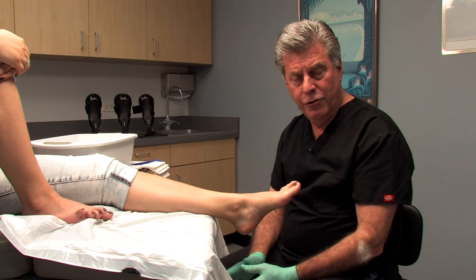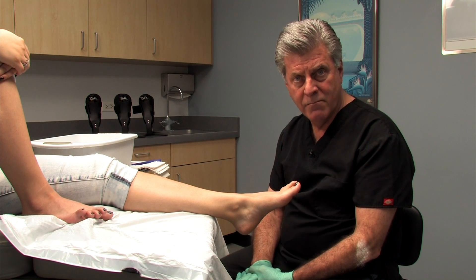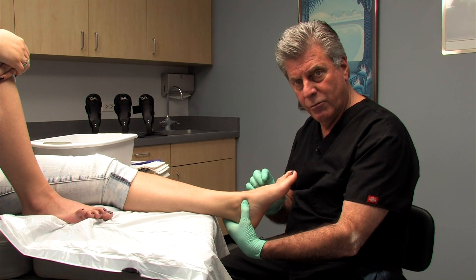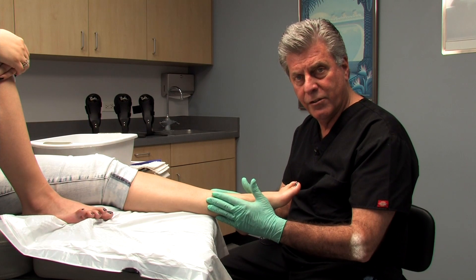I'm going to demonstrate the neutral suspension cast technique using plaster of Paris. There are a couple of essential parts of this process in terms of positioning of the foot, which we're going to go over, and it really all starts with the patient positioning when we begin the process.